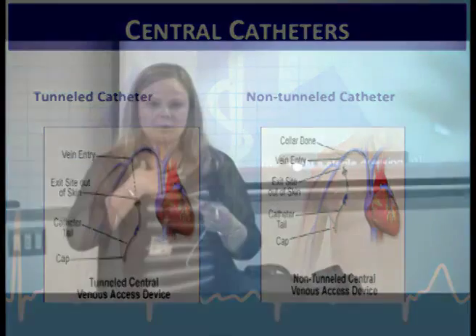arm here too. When we're accessing central lines, we're going to make sure they're unclamped, and the first thing we're going to do is pull back, because we don't want to push any air into the device, and if there's any in there, we want to pull back. So we pull back and we want to look for blood flow. That should indicate to us that brisk response that we're in the vein and that central line is in the vein.